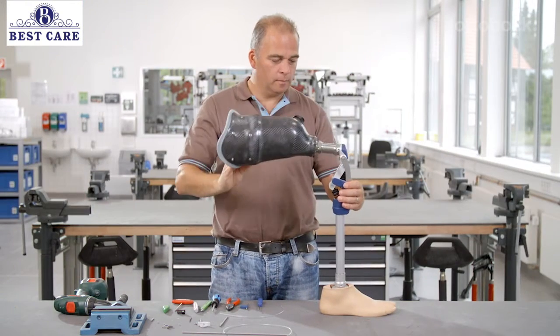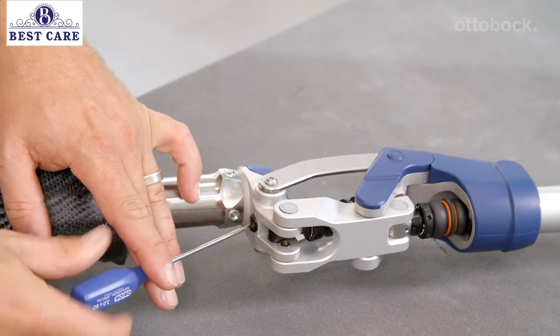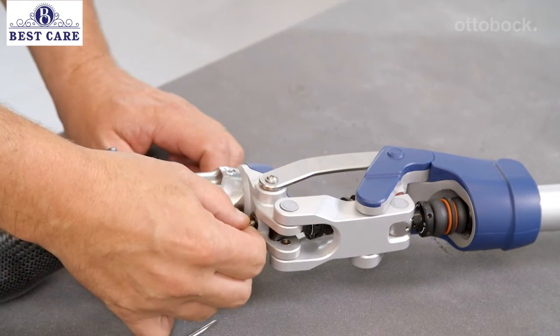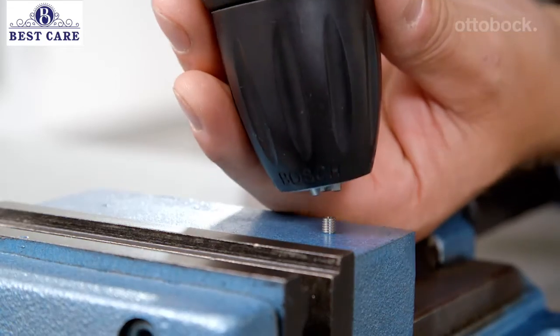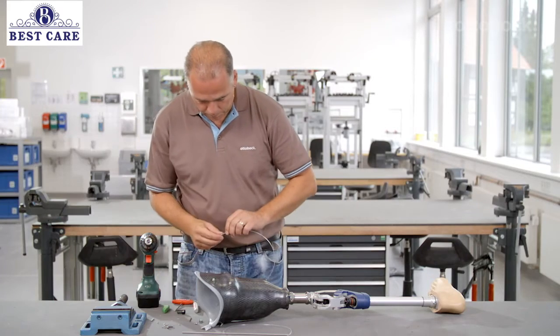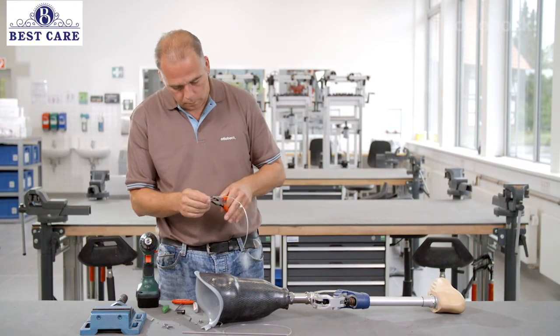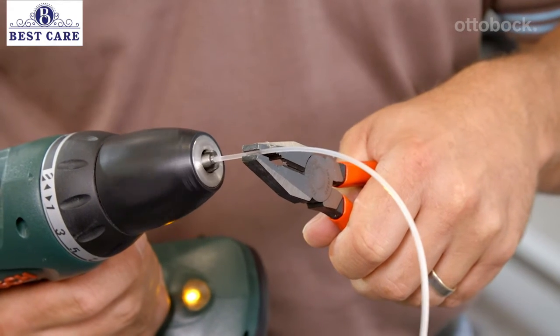Fion is delivered with the lock deactivated, and the knee joint can be freely flexed. Please observe the following instructions for installing the lock release cable and activation of the lock. After installation, please check whether the lock release cable has been installed in accordance with all the instructions. All instructions can be found in the instructions for use and the assembly instructions.